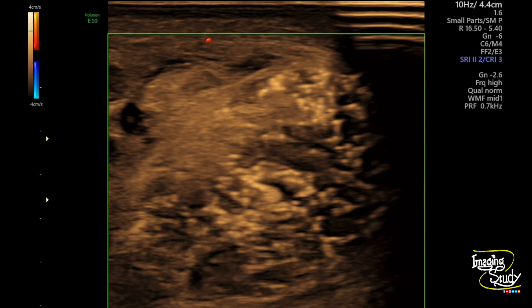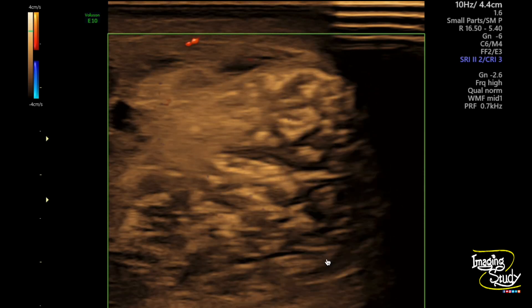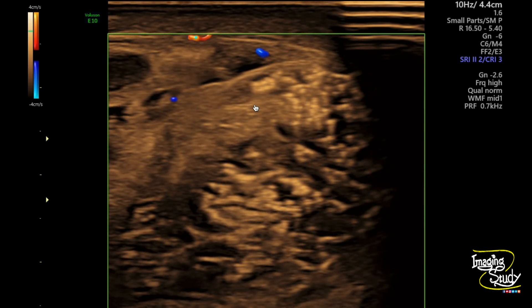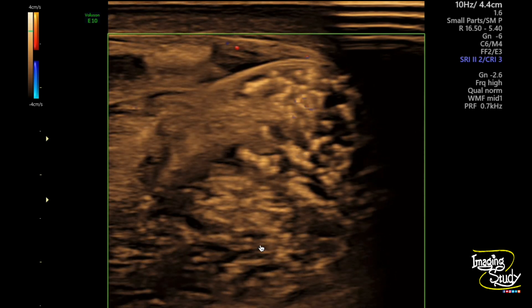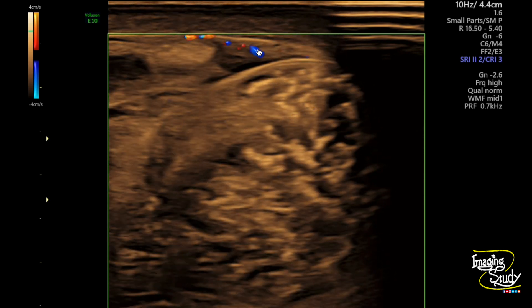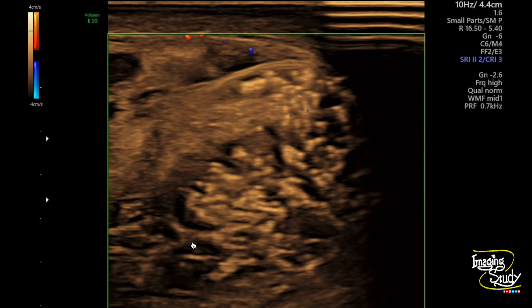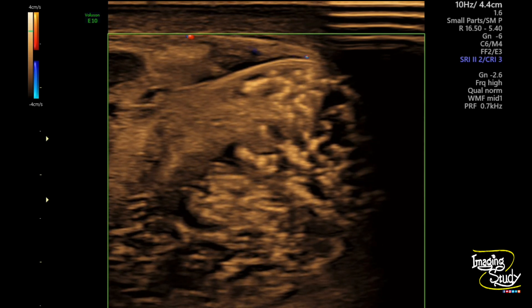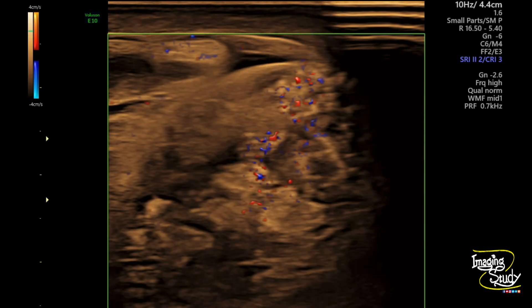Now here's the left side. You can see no vascularity within the testis and epididymis. You can see some skin flow here, but no flow within the parenchyma and within the visualized epididymis. This indicates left testicular torsion.